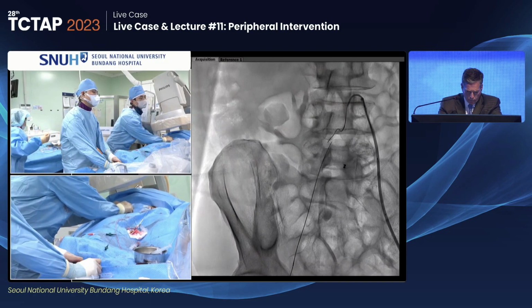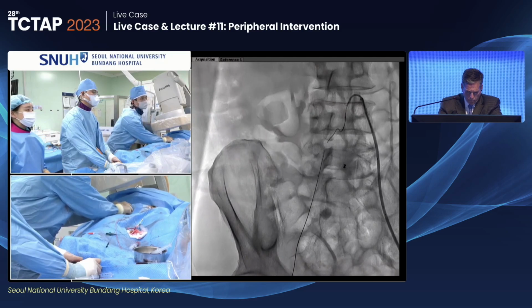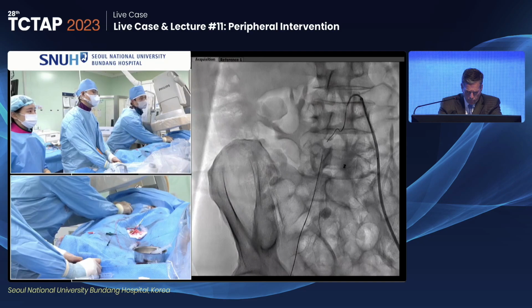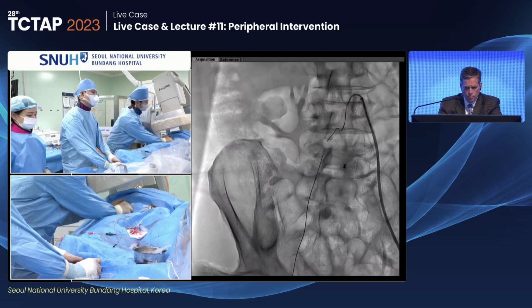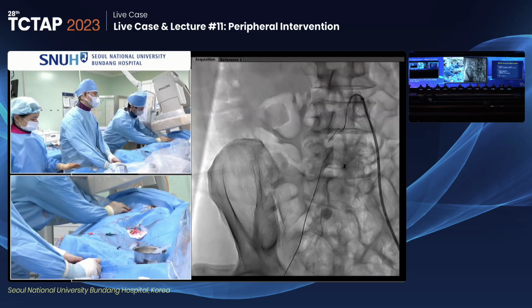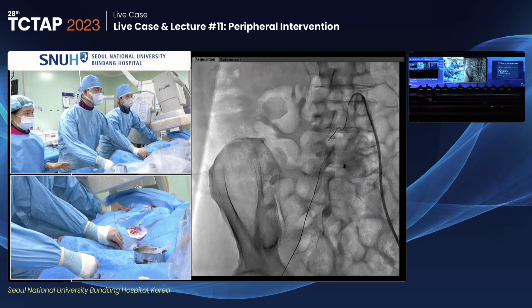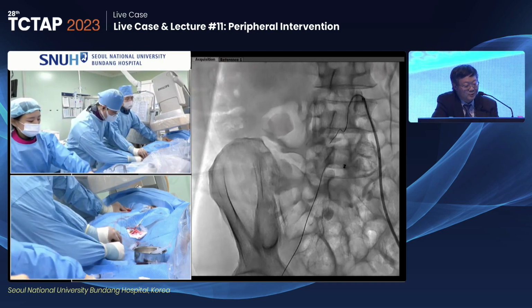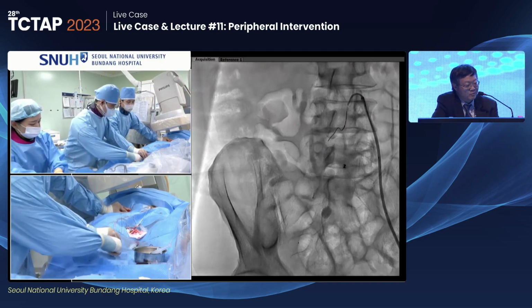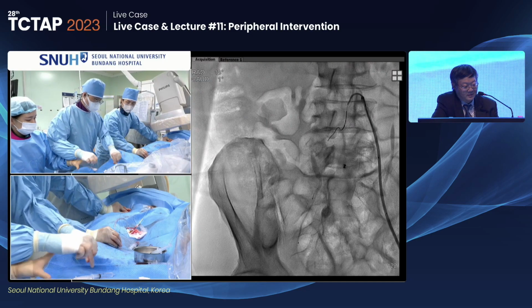Now I am advancing the support catheter, CXI, and it is approaching my side. Then I will change it to the 018 wire. Okay, please change to the 018. Very graceful. It's quite a good learning point for young physicians on how to save the sheath when your wire is kinking. So, okay, 018.